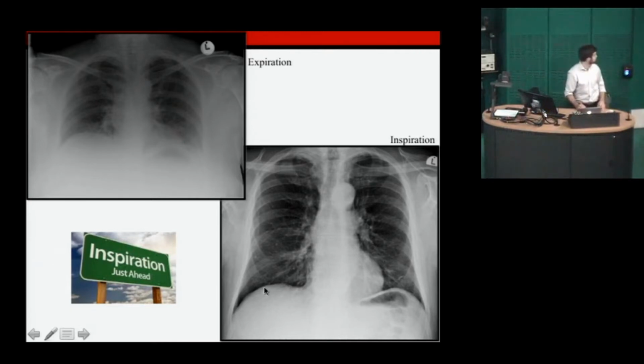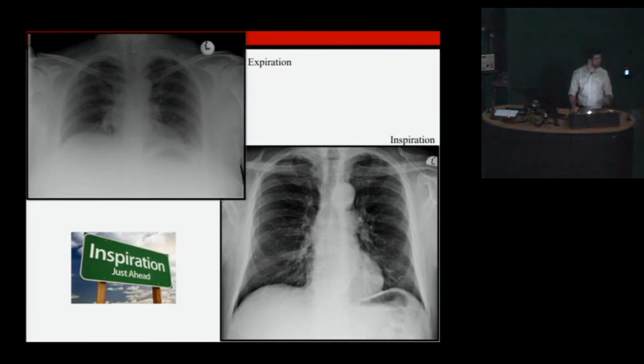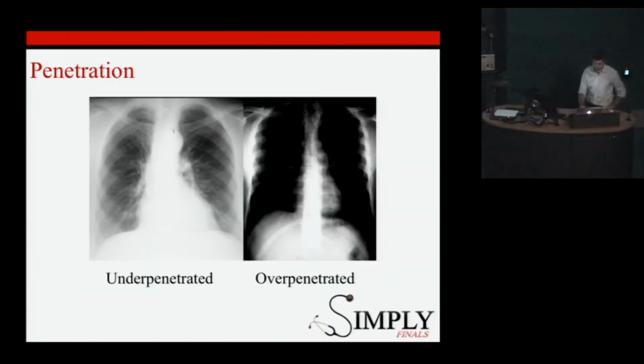Oh yeah. Thanks, Andy. Some mood lighting. Get in the mood. Just need some jazz music on. Get the chest X-rays out. Okay, so anterior ribs we were talking about, yeah. So penetration. Oh, right on cue. So, lost my place now. So many innuendos.